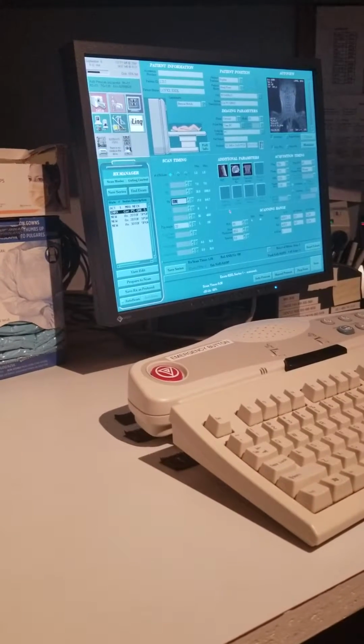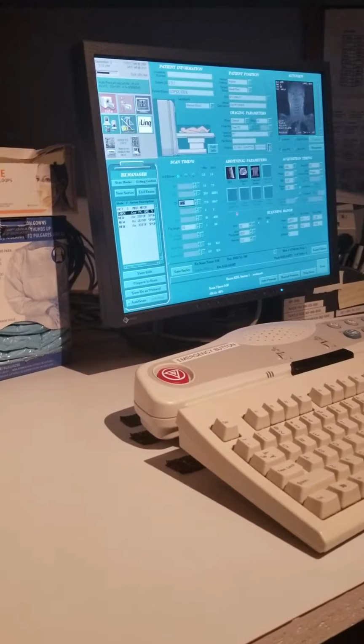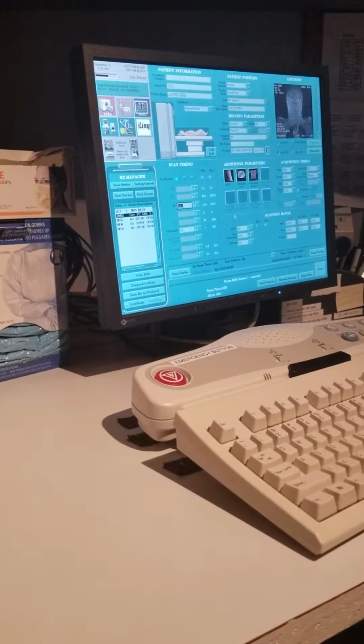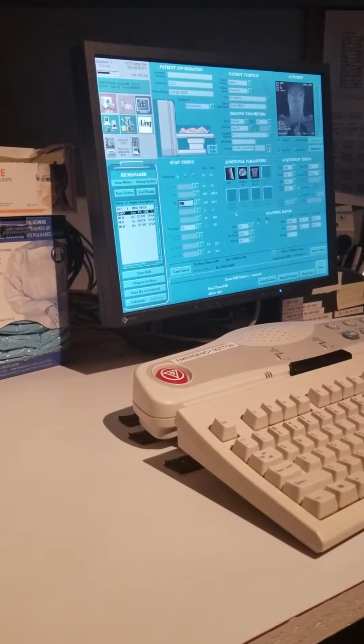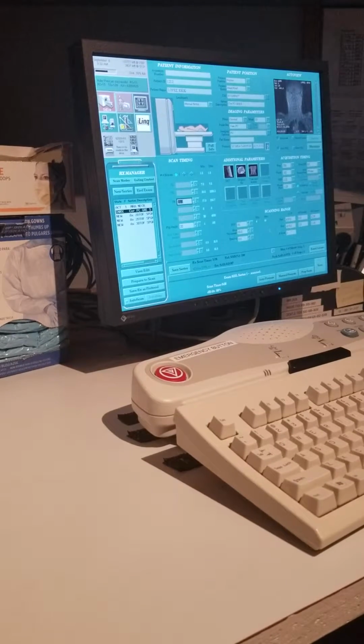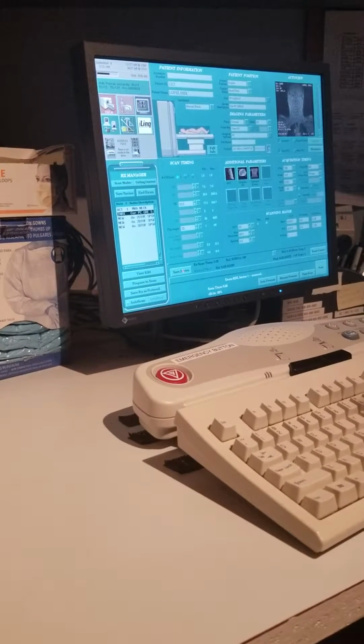When you do the sat band, you put it to a particular number for the venous to block the venous, right? So it won't block the arterial. Yes. So you'll see when we set up the next one. Okay. Go ahead. Are the numbers and everything okay? We don't need to do anything.